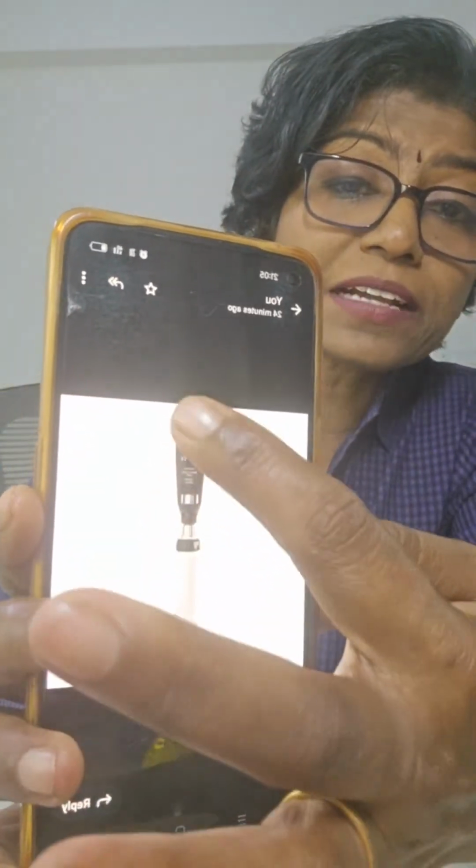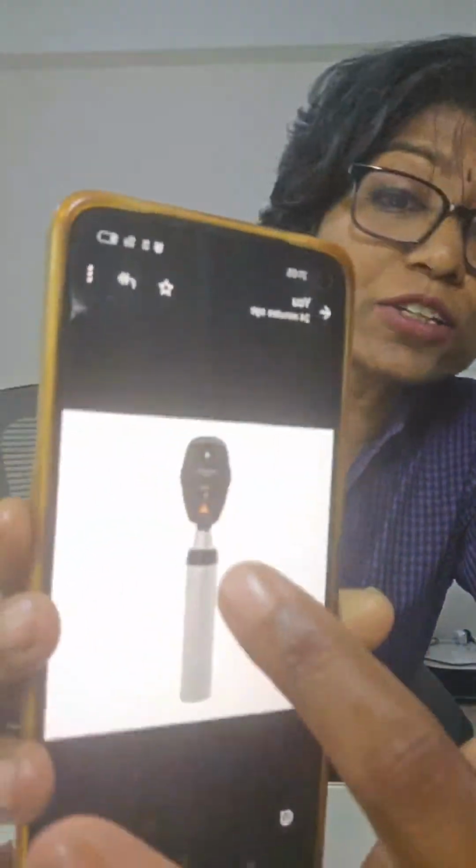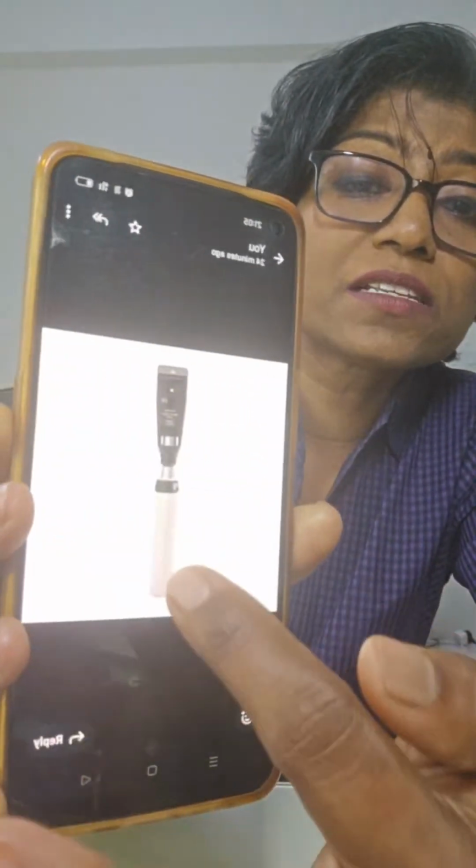So a retinoscope will look something like this. Something similar to a direct ophthalmoscope, but there is a difference. So this is how your retinoscope will look. It will be like a rectangular head, a sharp rectangular head, unlike your direct ophthalmoscope, which will have a little rounded head. It also has a handle. Look at this. Yes. So when you see the reflex, when you're doing the retinoscopy, I've taught you this in the main videos.